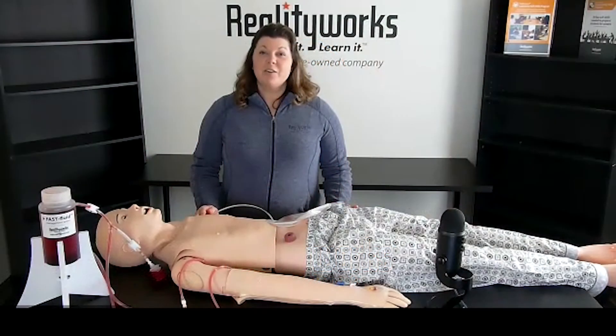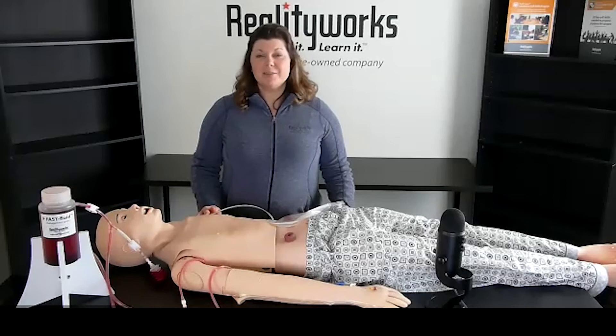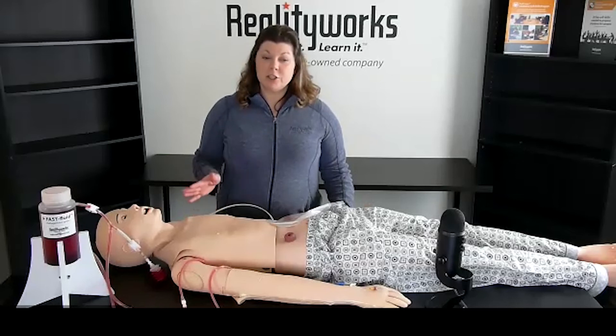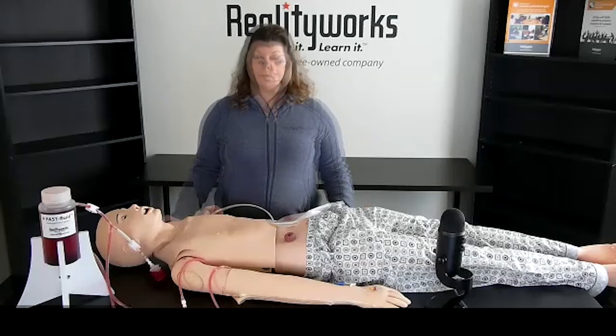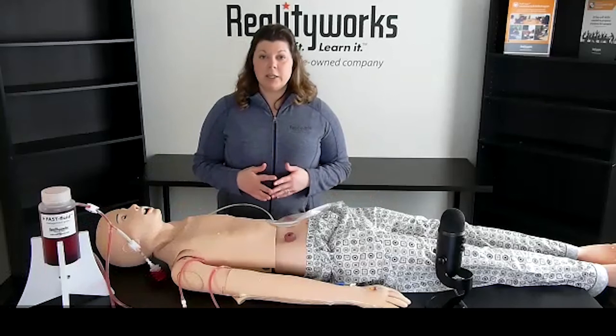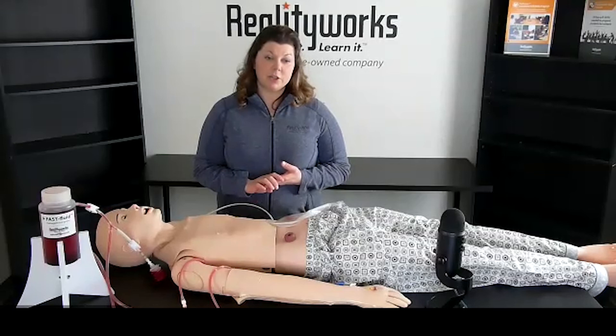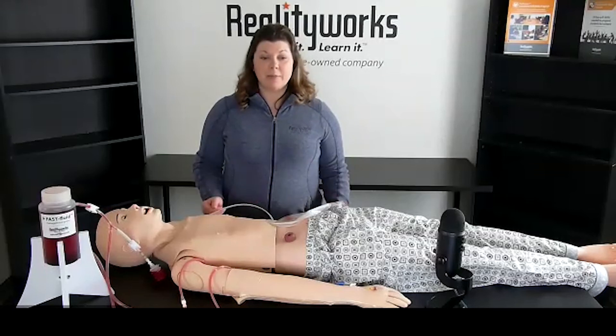The adult nursing mannequin does over 20 different cares and I just demonstrated three of them. This mannequin comes with a curriculum that is over six to eight hours long of teaching time. It includes presentation slides, student activities, as well as pre and post assessments. The curriculum includes basic bathing, catheterization, intradermal, intramuscular, IV administration and insertion, ostomy, phlebotomy, pressure injuries, and range of motion.